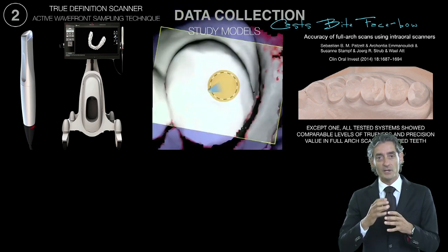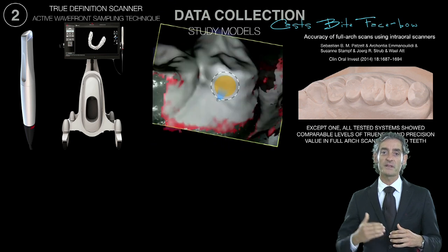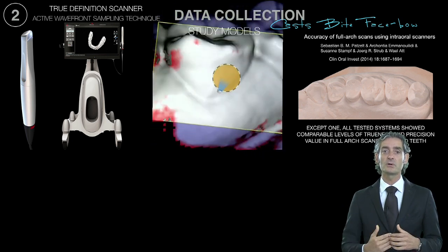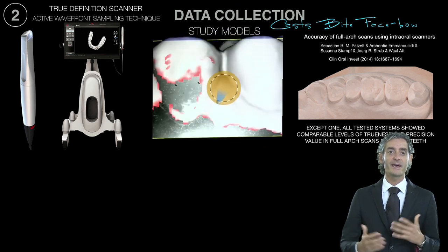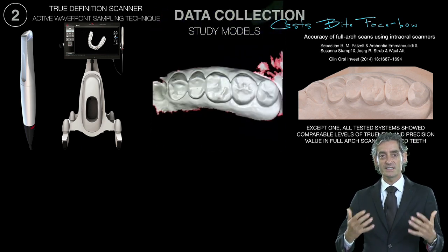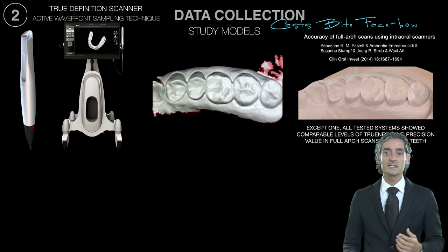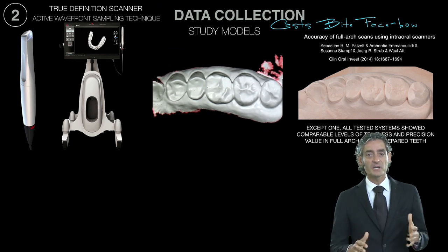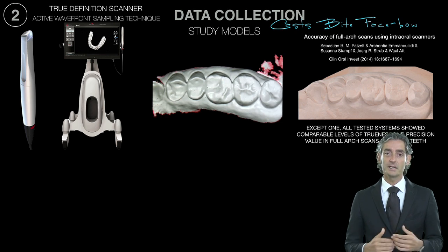It's quite easy, they are quite small, and we can also get the back part of our teeth, so the distal part of the molar, and it's quite easy. In 2.5 minutes we can take an impression. And as we see, this is not only the impression, for us it's also the digital cast, as you can see here in detail. And right now also the accuracy of this technology starts to become really important.